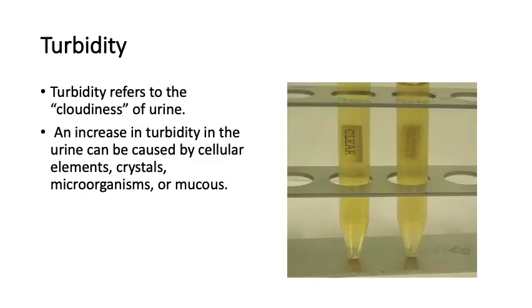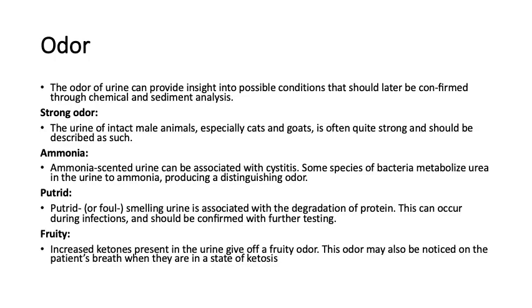We examine turbidity in a clear container of a standard depth. A good choice is a urine tube or sterile red top blood collection tube. Horses and rabbits typically have turbid urine. This is due to the presence of mucus and calcium carbonate crystals. Therefore, turbid urine is considered normal in this species. Again, it is important to use standard terminology to minimize discrepancies among technicians.